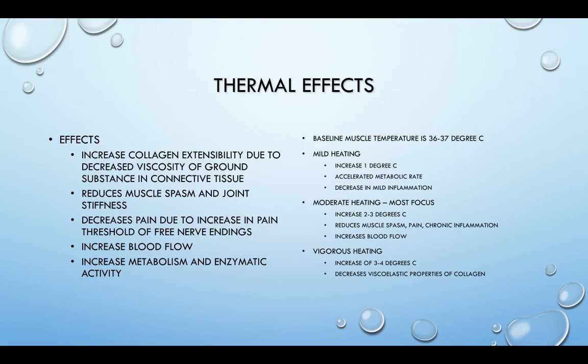There is some evidence that preheating with like a hot pack, okay, for about 15 minutes, so doing that superficial heating, can actually allow you to then decrease your ultrasound time by about 2 to 3 minutes if you're trying to do like 1 megahertz to get into muscle or tendon. Because you're already pre-warming the tissue, you can usually cut your treatment time maybe down by 2 or 3 minutes. It's not necessary, but it's something to do if maybe you're strapped for time, that the person can be heating first and then you do the ultrasound treatment.